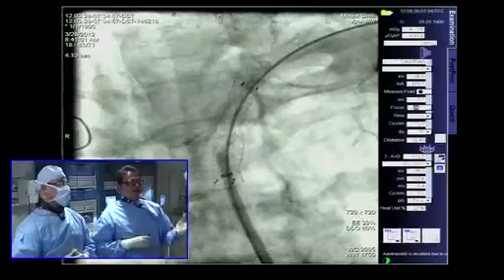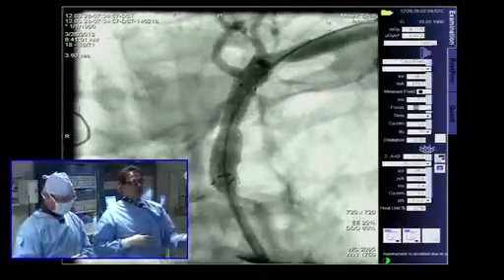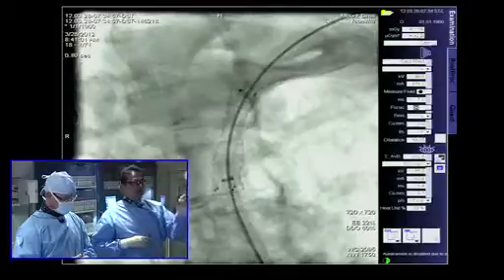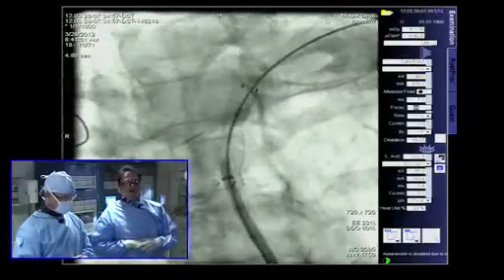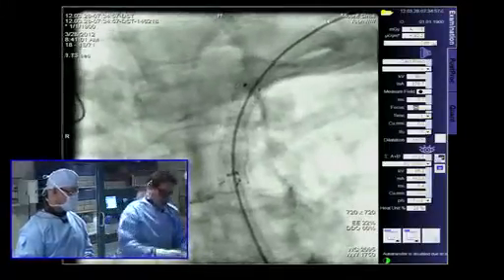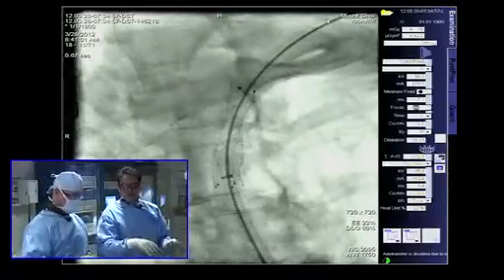We know that gradient produced significant LIMA ischemia. We saw the flow was extremely poor both in the LIMA and the vert. Now in our post shot here, you can see a robust flow in the vert, robust flow in the LIMA with a wonderful placement of this stent. So I'm just going to go ahead and check a gradient, and obviously I don't have 2 transducers, but we'll try to do our best. Let's see whether we can get 2 transducers set up, guys, while we do this. And then we'll go ahead and decide what we want to do.